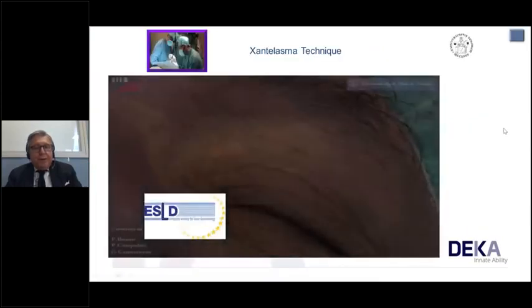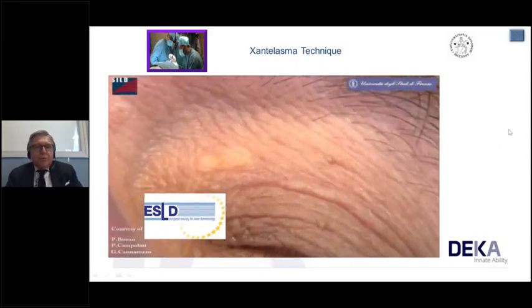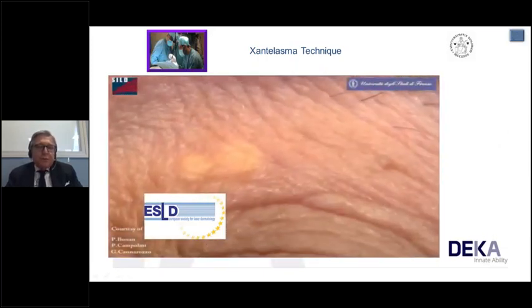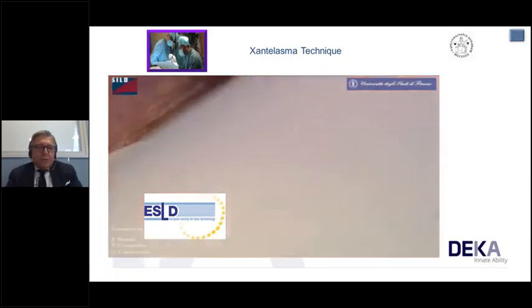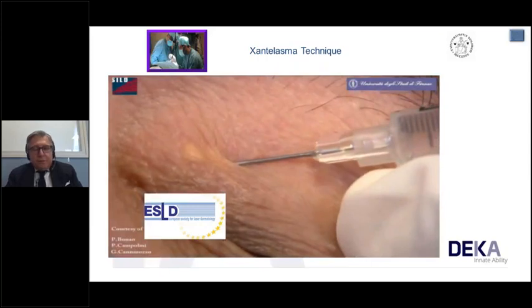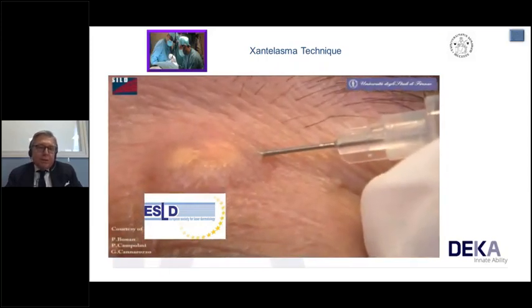Well, we have here another video that is recommended to observe with attention, because we can appreciate not only the passes that we use, but the safety measures, adopting the metal corneal shields.